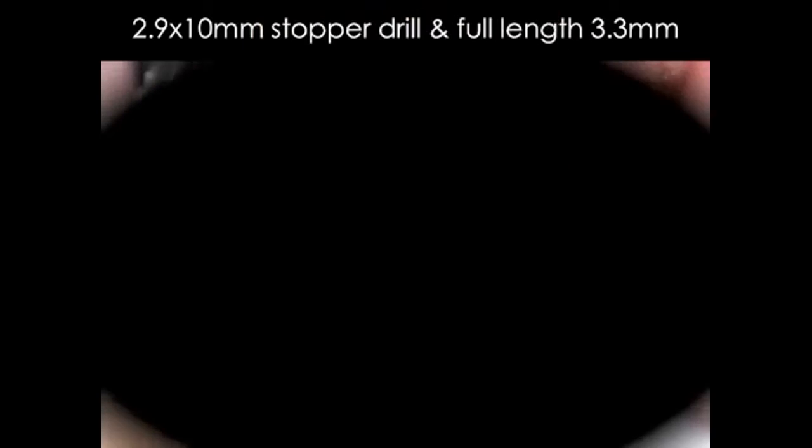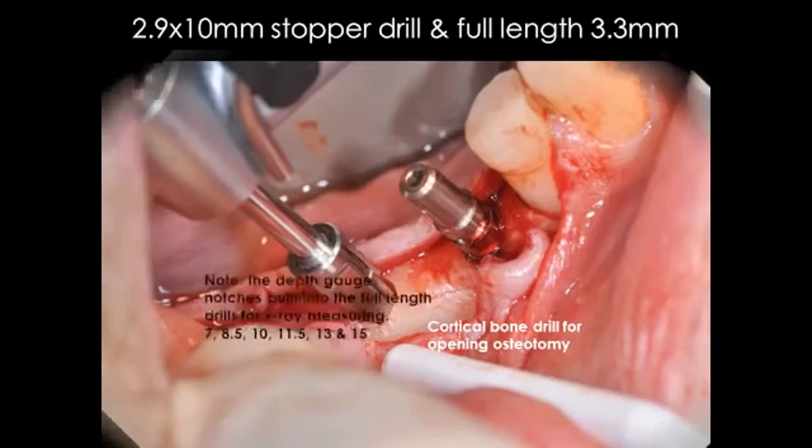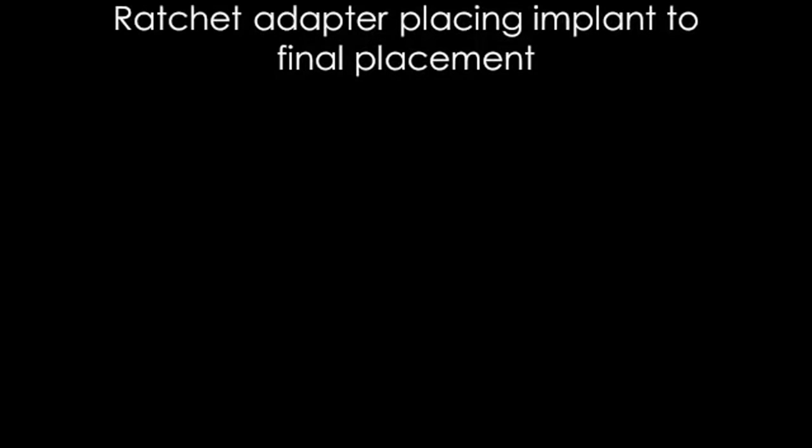Now here, there's a 3.3 drill, and then your dense cortical bone drill. We did open that up a little bit because we ended up using a 4.5 implant in the posterior based upon that. Now you can see the really nice depth gauge that's built into your drill, which is a really excellent aspect of the particular marking drills, or what we call your longer drills.